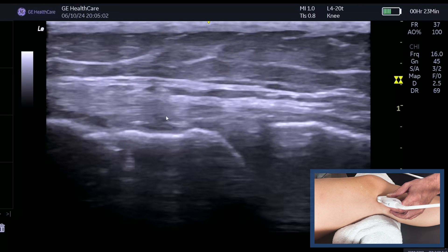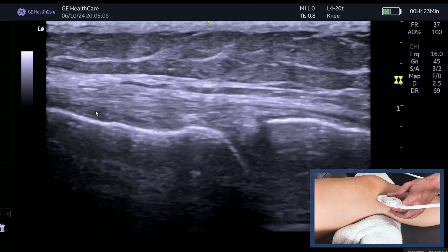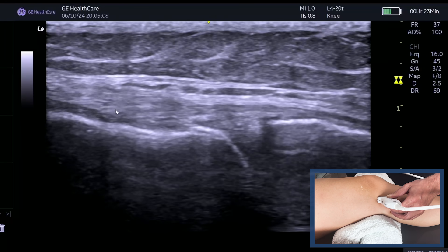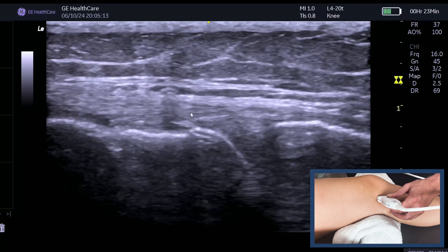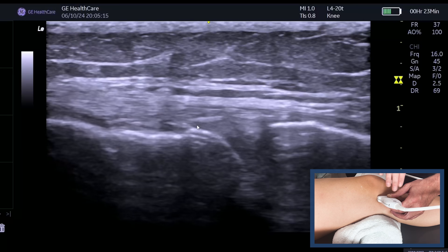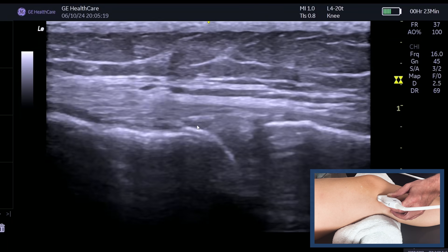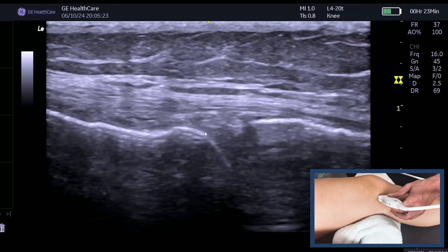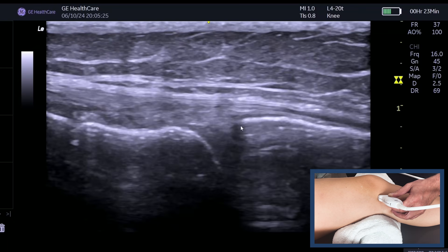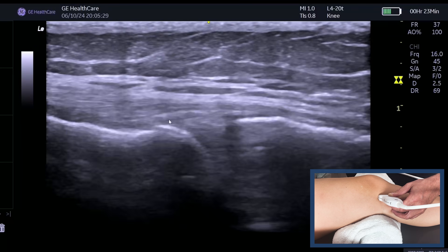Following it back up, this is the superficial part, and we can see where it attaches onto the femur. Remember, it's this femoral side where you get quite a few of the injuries. The deep fibers are more towards the bone — they don't have a nice fibrillar pattern because the fibers are more oblique and multi-directional.